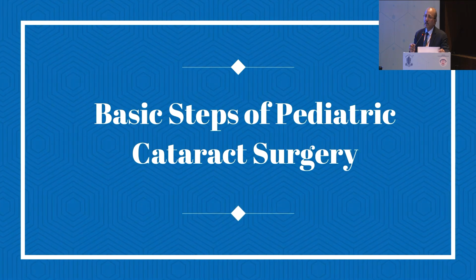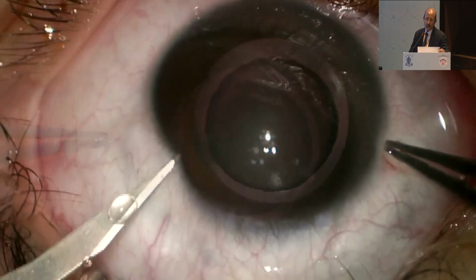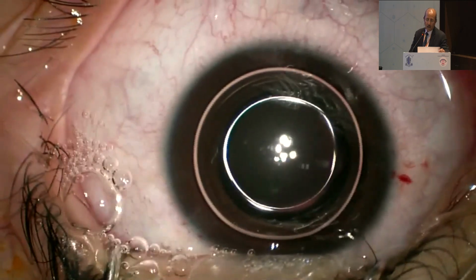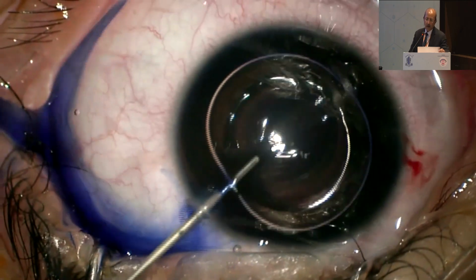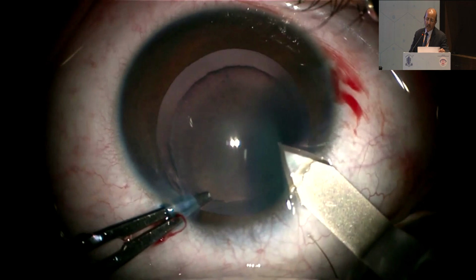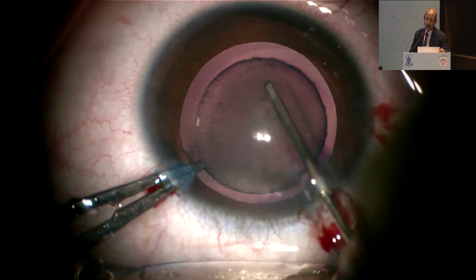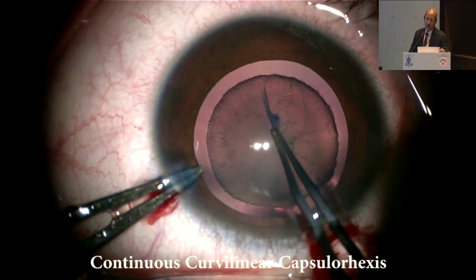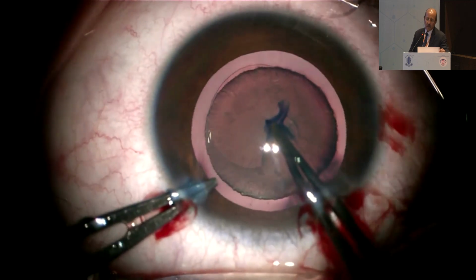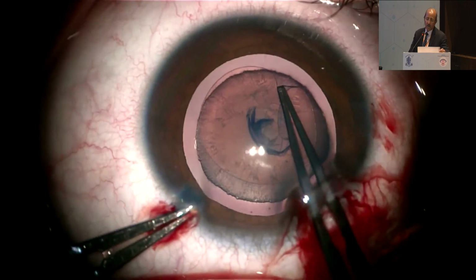First, I would like to show a small clip of zonular cataract. This is a child with classical zonular cataract. To demonstrate, stain the anterior lens capsule with trypan blue dye and make a continuous curvilinear capsulorhexis. The size of the rhexis is kept around 5 millimeter or so.